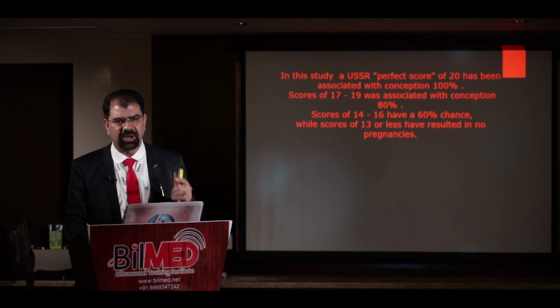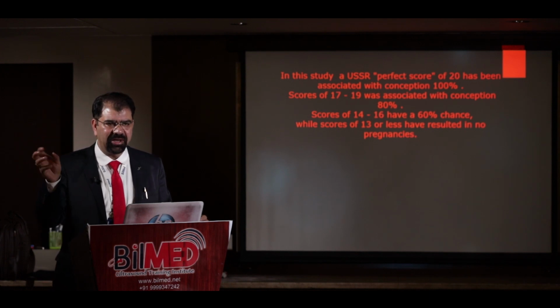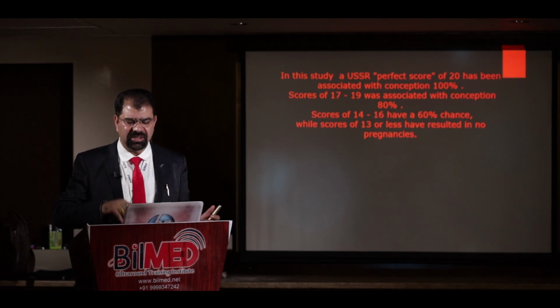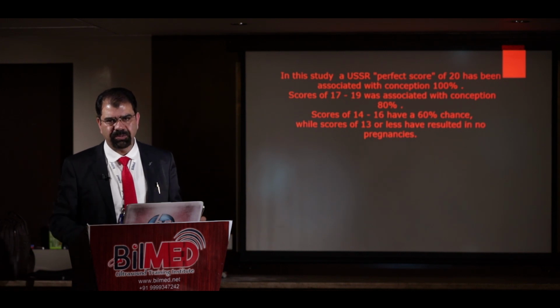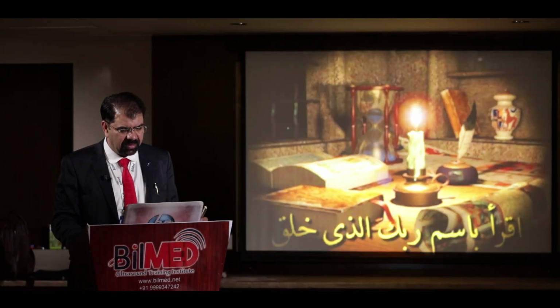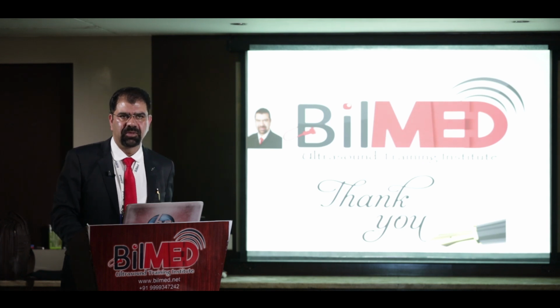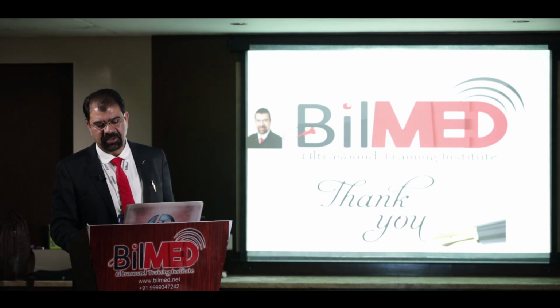That is very important. And when you are looking for this follicle, when it will rupture, what are the signs, and what is the growth, by which pace it should grow, that is already discussed with you. So this is all from now for this pelvic scanning. Okay.